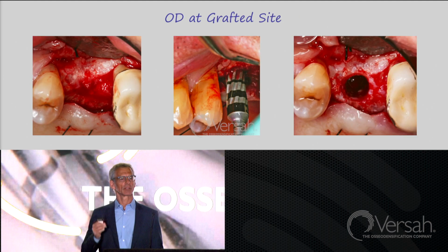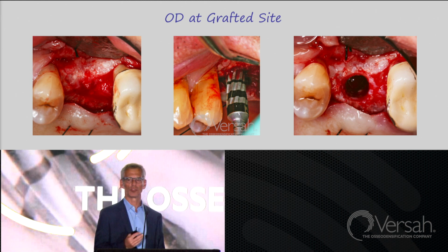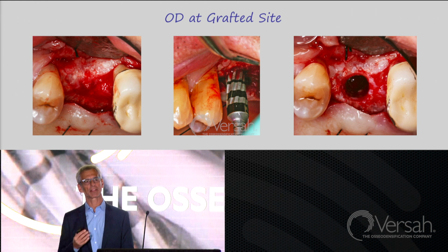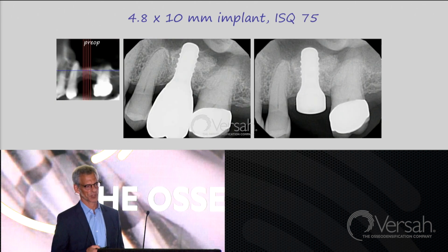And always, osseodensification in my staged sinus grafts. Improve what I have. Make the most of what the patient has. 4.8 by 10 and restoration.